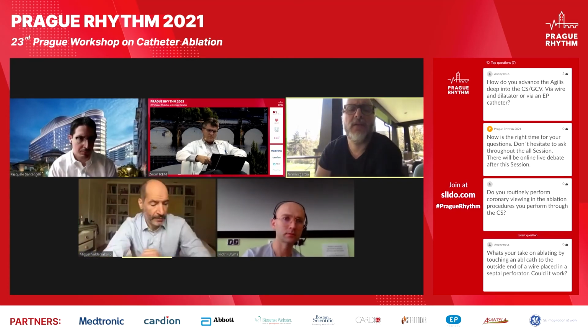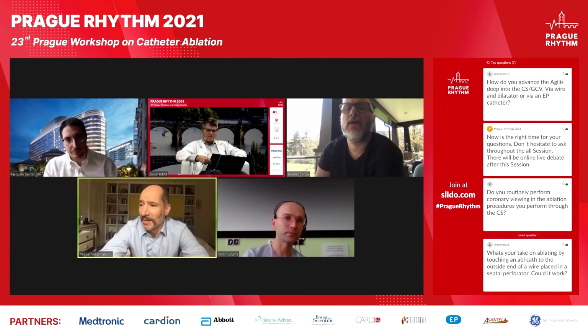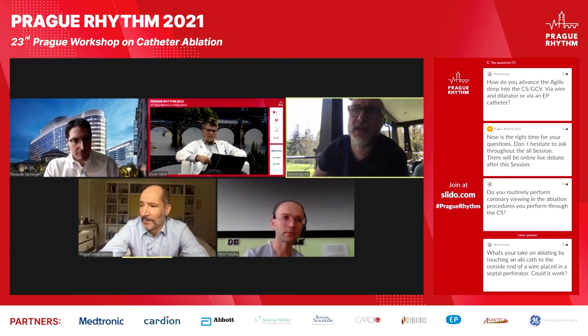Why not? Anywhere. If you're right opposite to it, within half a centimeter... Well, I was trained to ablate where the lesion is best, and I still believe that paradigm. Yeah, but a huge lesion is not best. A huge septal infarction is not best.